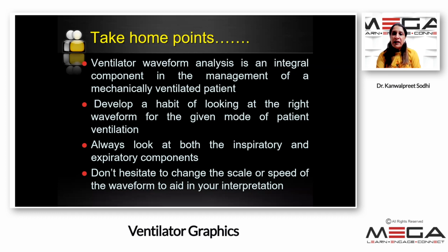Actually, I'll say that once we are versed with the ventilator graphics, they are like magic wands for us. It's wonderful because standing at the patient bedside, understanding the different aspects of ventilation and using them in the clinical management of the patient, that is a wonderful thing. So that certainly makes a lot of difference.